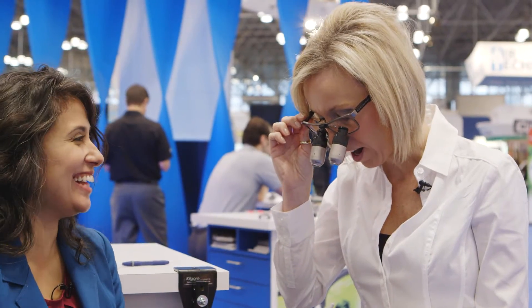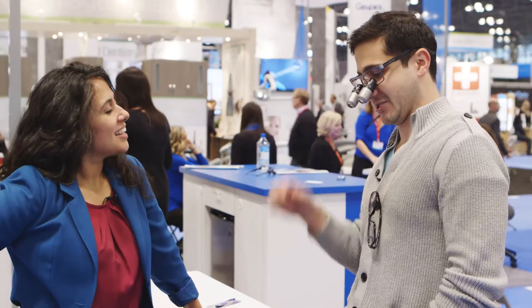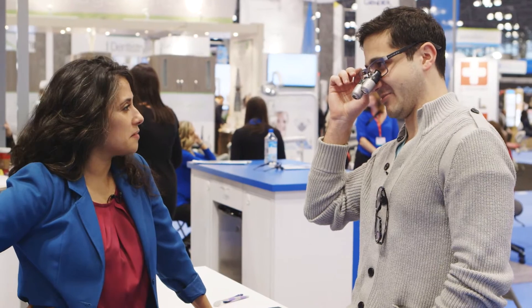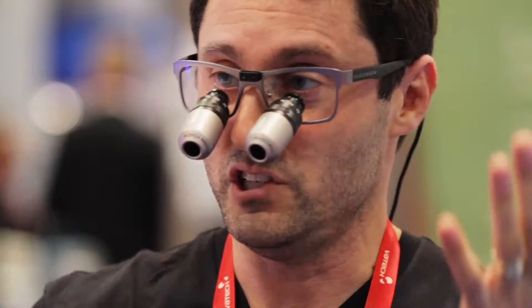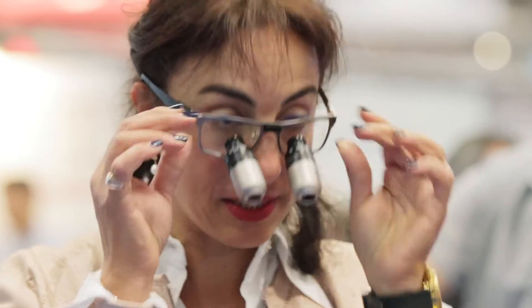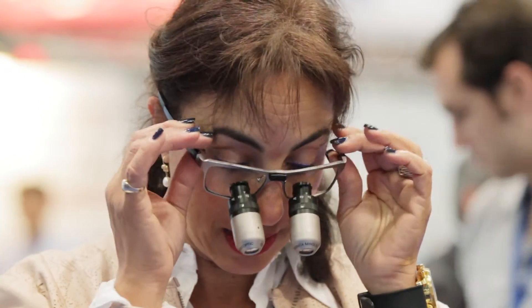Shut the front door. Wow, these are pretty light — I'm actually surprised, I thought they were going to be a little heavier. It feels light. These things are so light and I don't have to change anything. It's extremely light and weighted very well. I find it's very light — it doesn't bother my nose, and it's very comfortable.